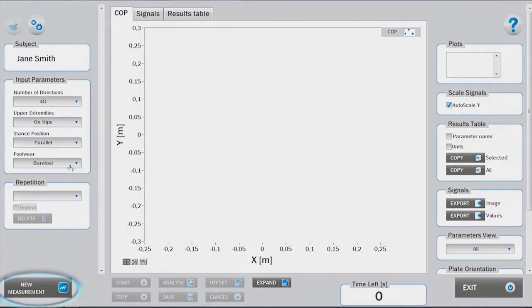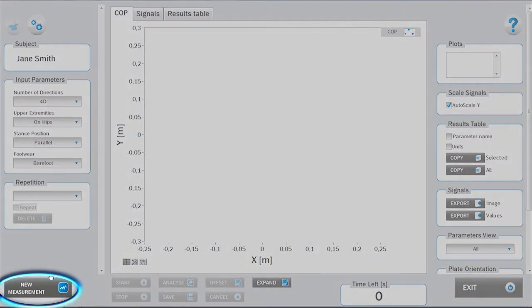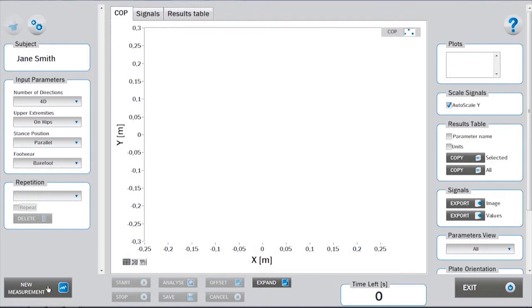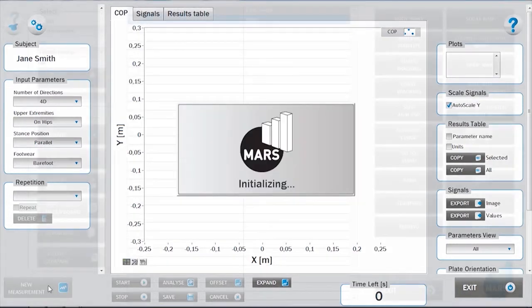To start with a measurement, click on the New Measurement button. After launching the test module and clicking New Measurement, initialization and offset takes place.